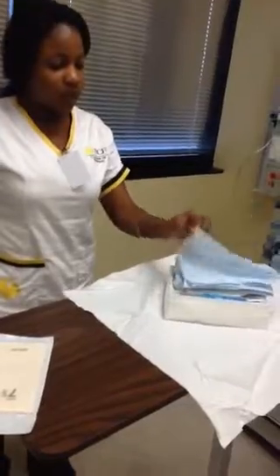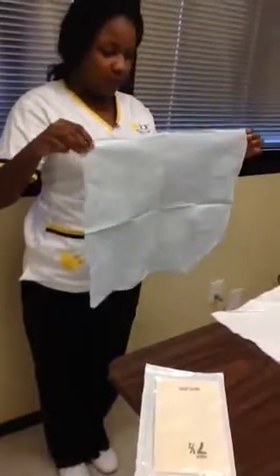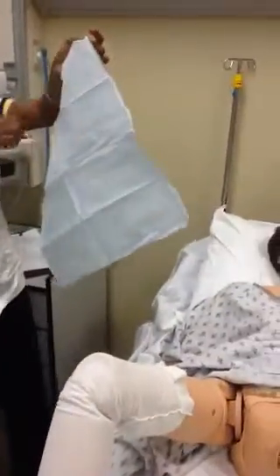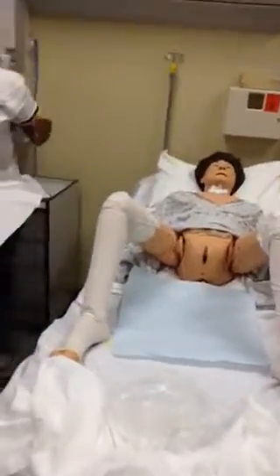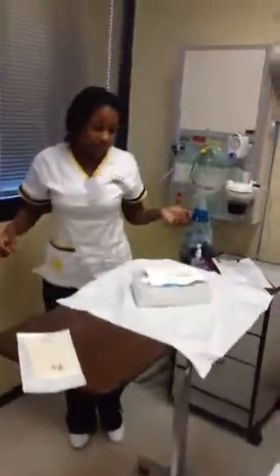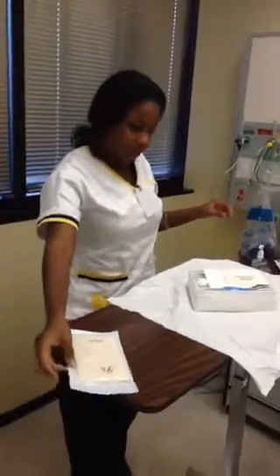So I'm going to open it, step back, open it, only touch the 1 inch margin, go to the wound, make sure that I do not touch the patient's legs. Okay, step back, done. Now I'm going to apply my gloves.